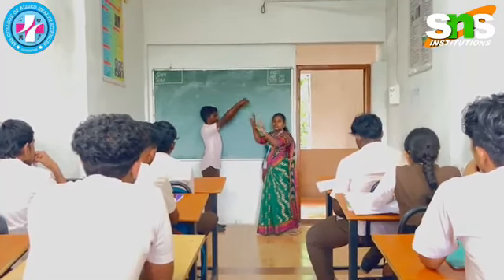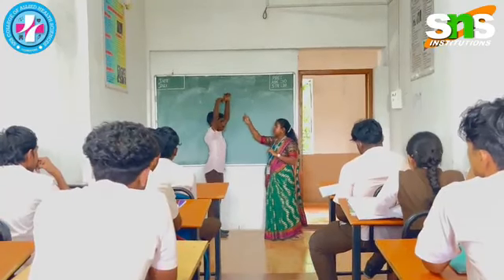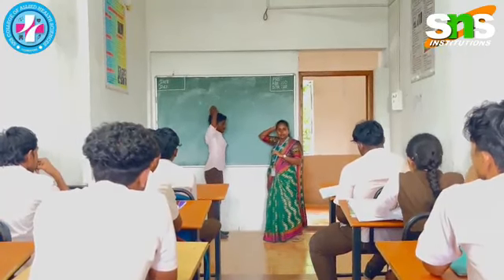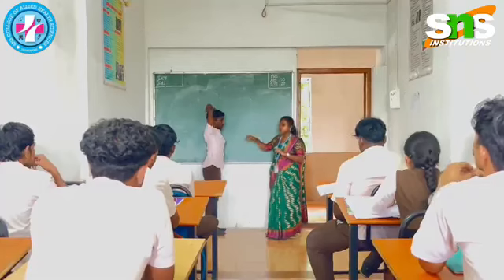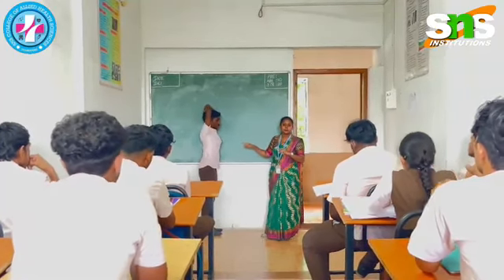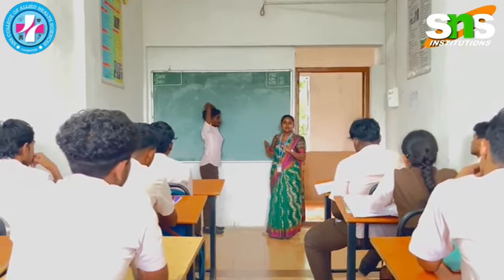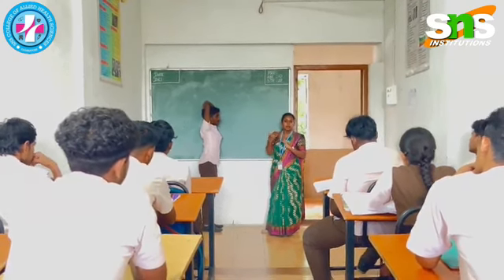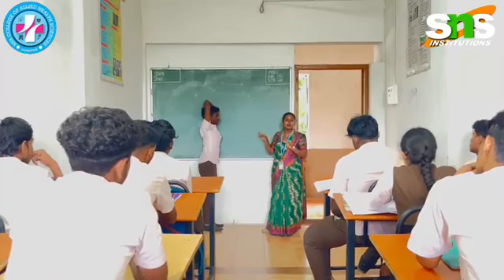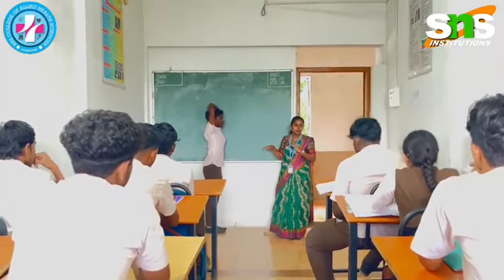The patient has to extend their hands above their head, and they can keep them at the back side of their head. So this is the lateral projection, and we have to instruct the patient to be in breath hold position. If the patient is in breath hold, the lungs will get fully expanded, and there will not be any artifacts during the exposure.